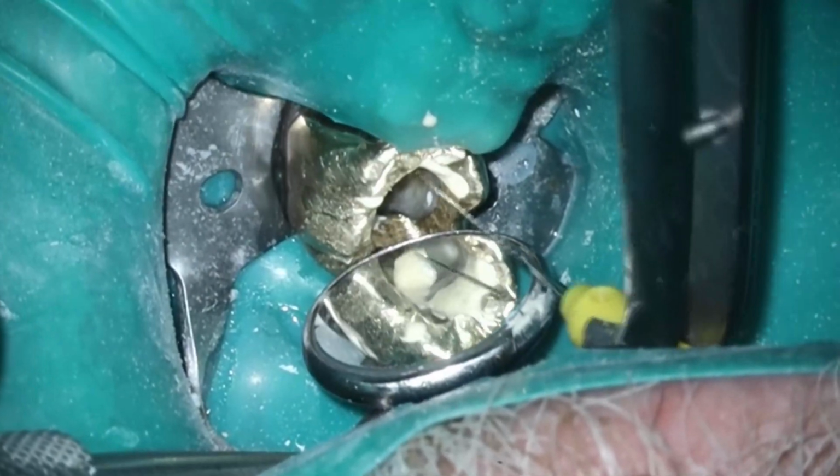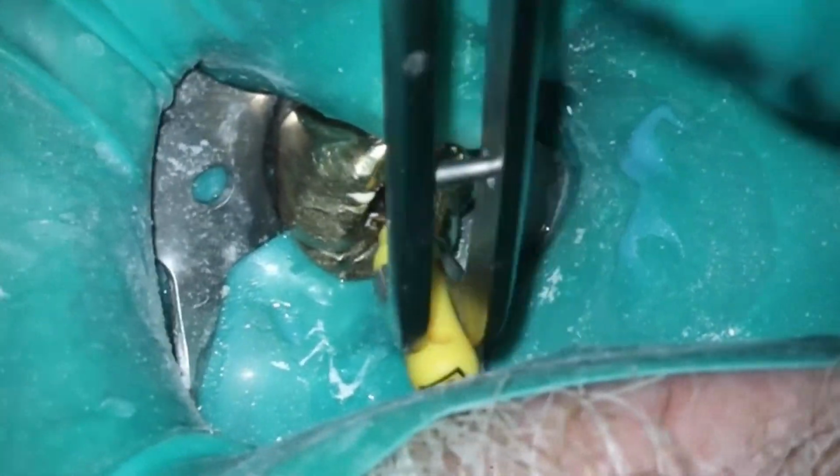So there's a few different ways if you're trying the squirt technique and you cannot get down to length with it. At this point it should be even with that hub. First thing is do some watch winding back and forth. Definitely the best video of me watch winding with my giant hands. You can't see anything.